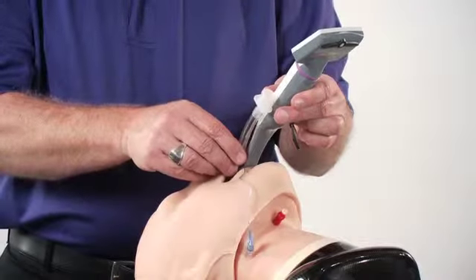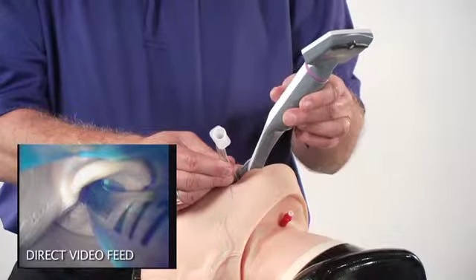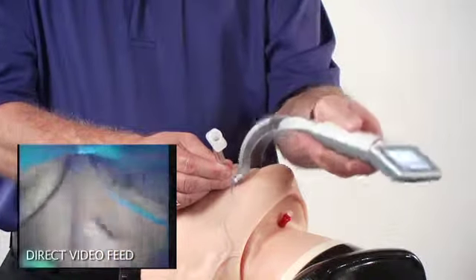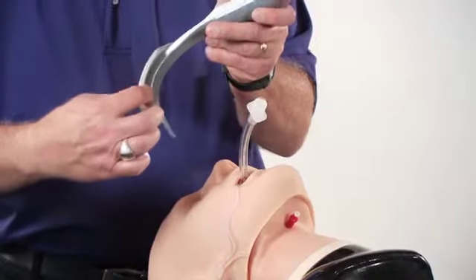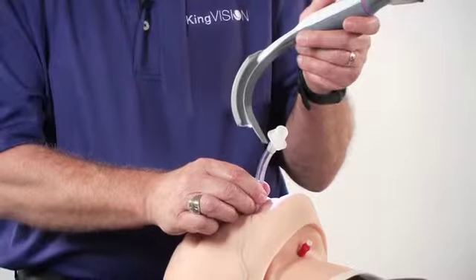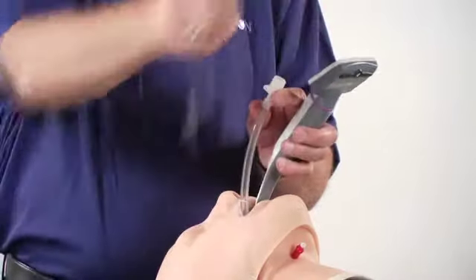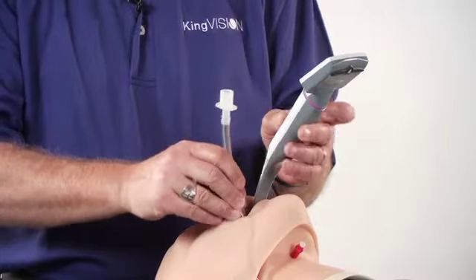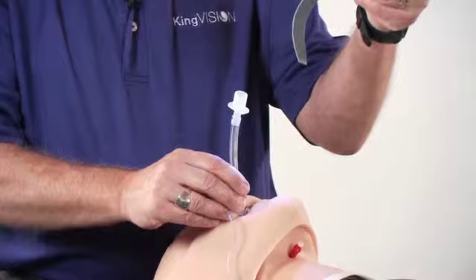To remove the tube from the channel, simply stabilize the tube off to the side to the right as you withdraw the blade from the mouth. What happens is this soft, flexible overmold prevents any catching of the tube as you're separating it from the track. With the standard blade, it's important to remove the stylet entirely, make sure the tube is advanced appropriately into position, and then just simply remove the blade from the mouth.